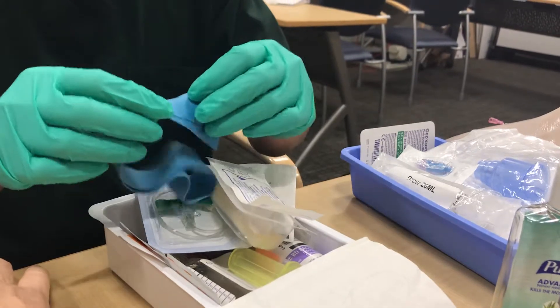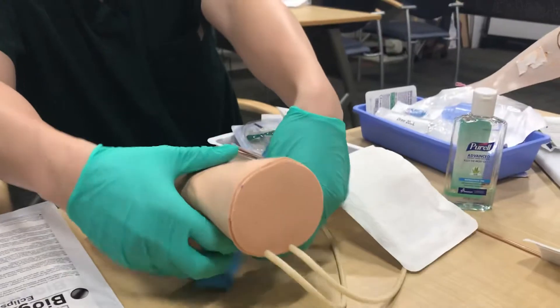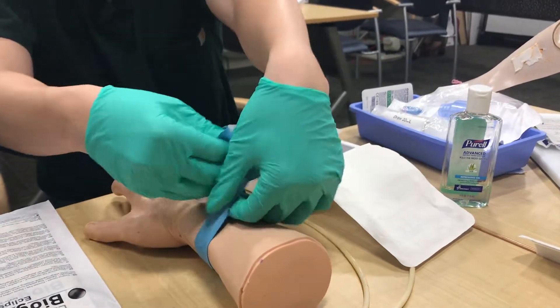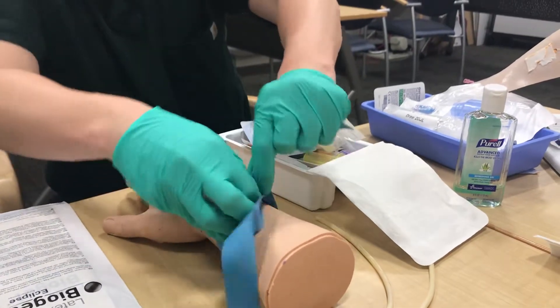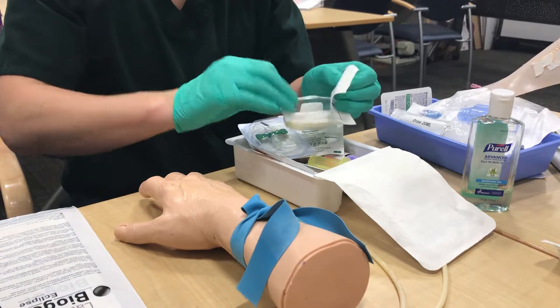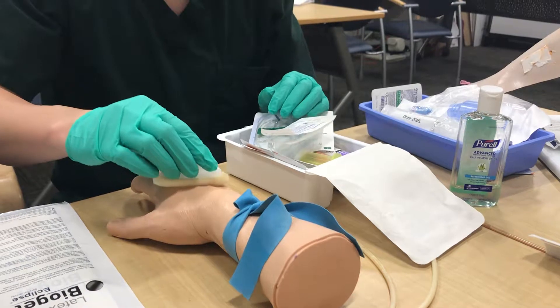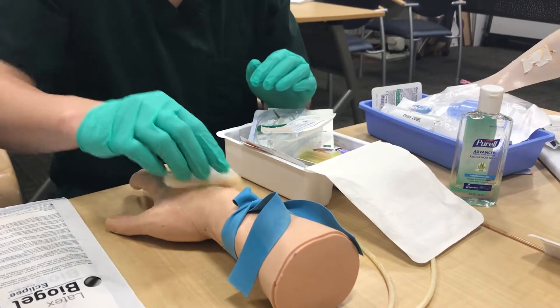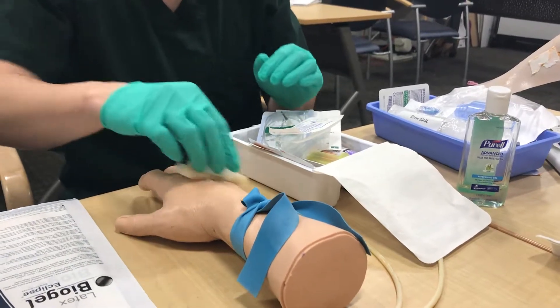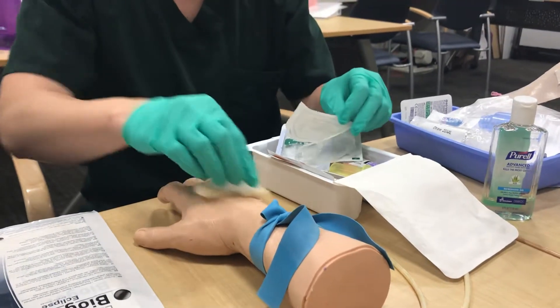You're going to evaluate your site, put your tourniquet on, and take a look. Tie your tourniquet and do some cleaning. Grab your chlorhexidine, scrub for a good 30 seconds, and allow for usually 30 seconds to a minute of dry time. While it's drying, you can prep everything else.